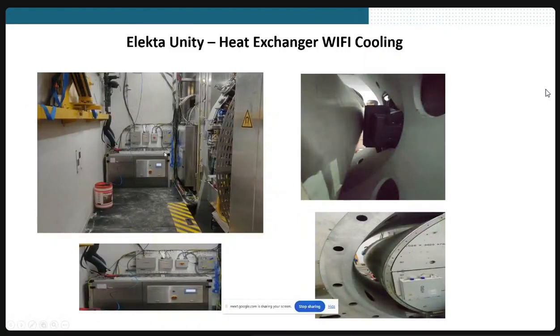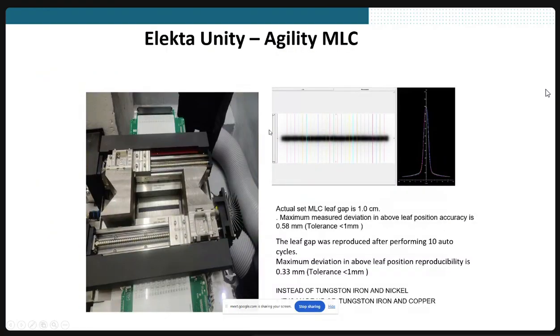and goes back to this area, this chiller. But this chiller is never connected to the machine because the machine continuously rotates. So in that case, the cooling is also, we call it Wi-Fi cooling, in the sense that the system dissipates all the heat energy to the atmosphere. From the atmosphere, this heat exchanger absorbs the heat and cools down the atmosphere. So that's the beauty of the system. And also the interlock and the data are transmitted over Wi-Fi. So really a very high-end sophisticated machine.